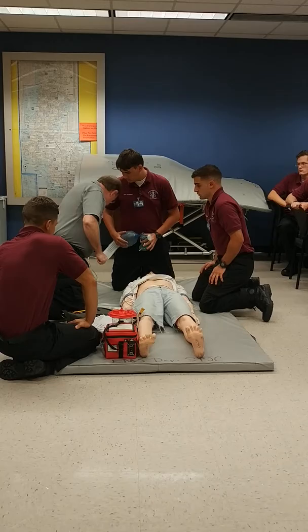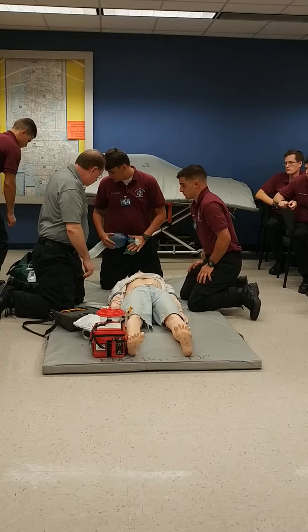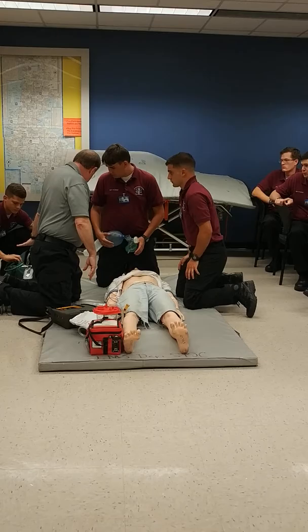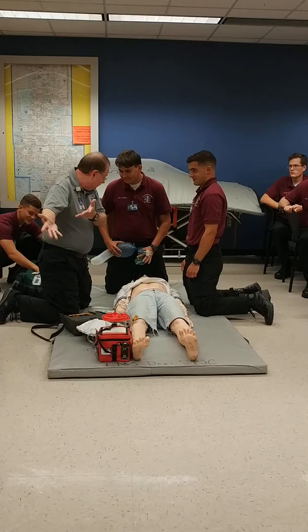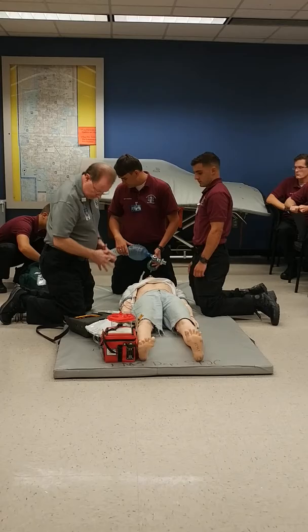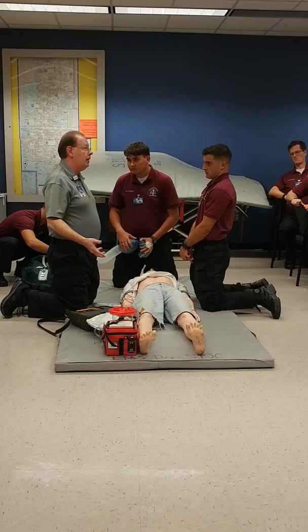What can the fourth person be doing? Get the oxygen hooked up and flowing. Then start setting up the King airway. Now we're coming up on the one-minute mark — whoever's at the AED needs to keep an eye on the time, giving the team a heads-up: you've got another minute, 45 seconds, and a 10-second countdown.